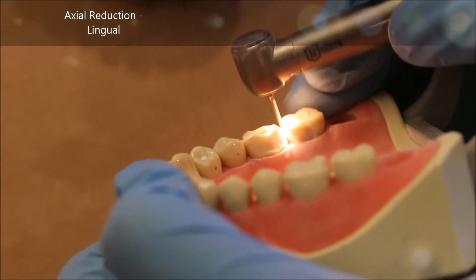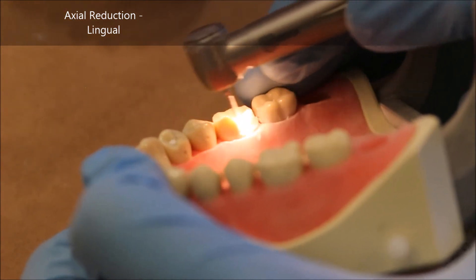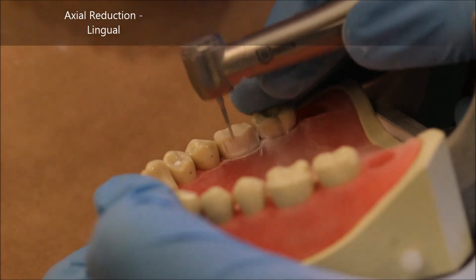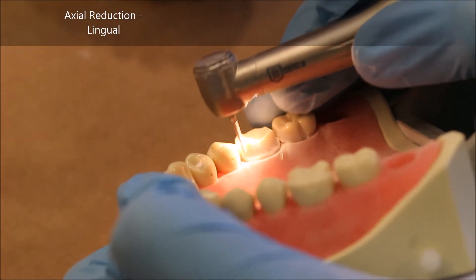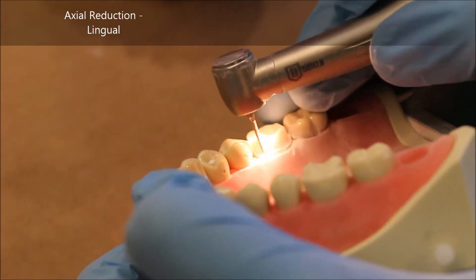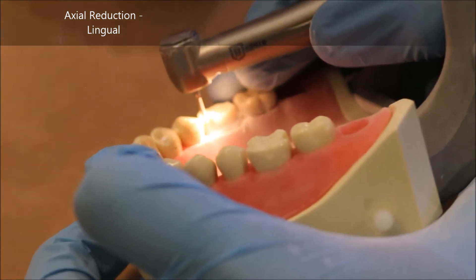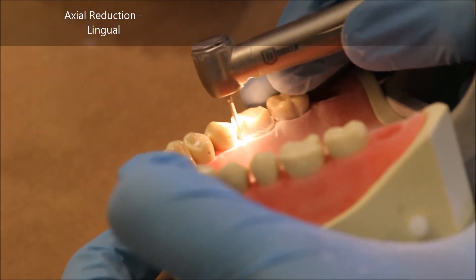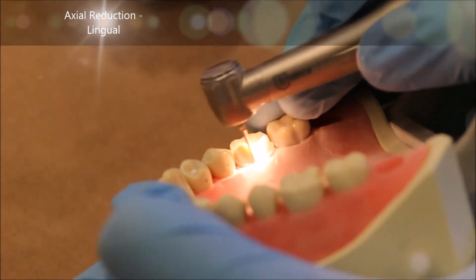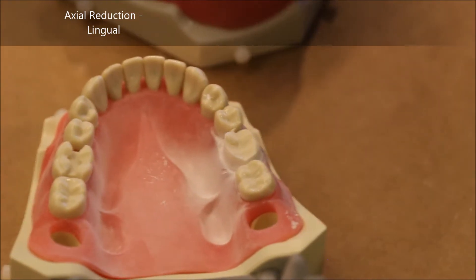I'm being as careful as I can so as to not create an undercut. If the burr is angled incorrectly, you can create an undercut which becomes rather difficult later on to remedy. A useful trick when taking it into the interproximal is to keep coming back and planing the surface, making sure your lingual or buccal walls don't have any sharp corners — ensuring a very smooth transition between where you have your chamfer and where you start breaking your contact.